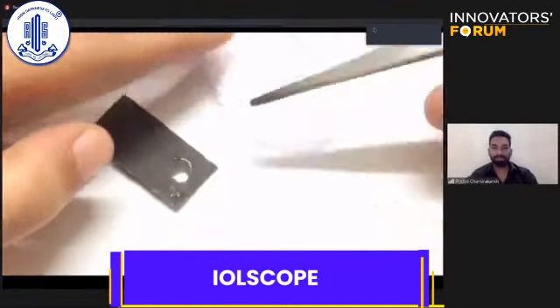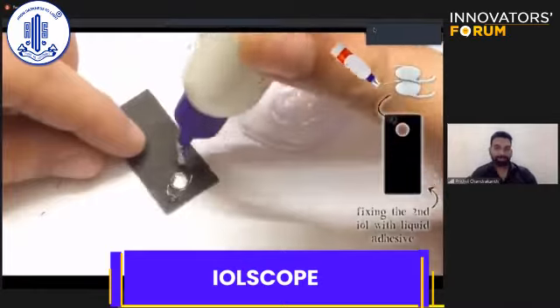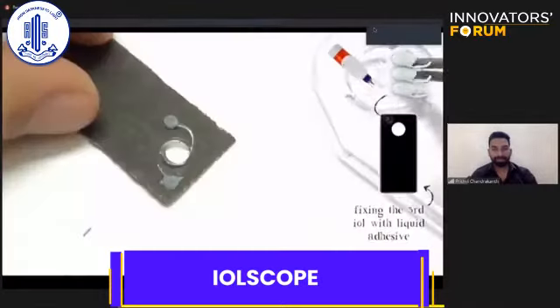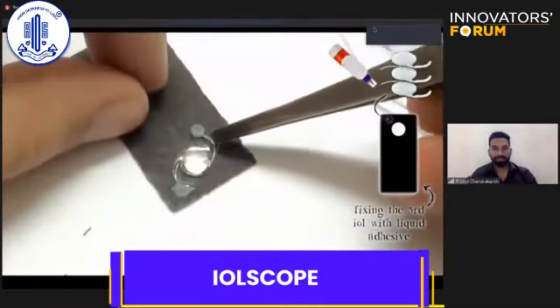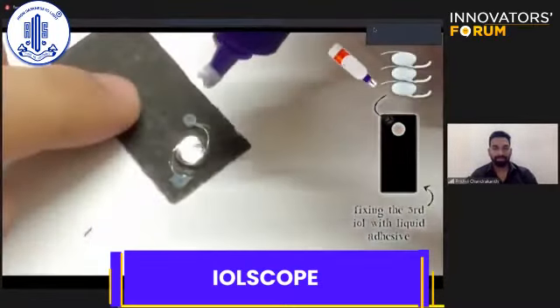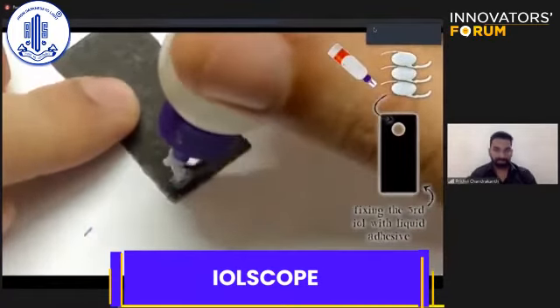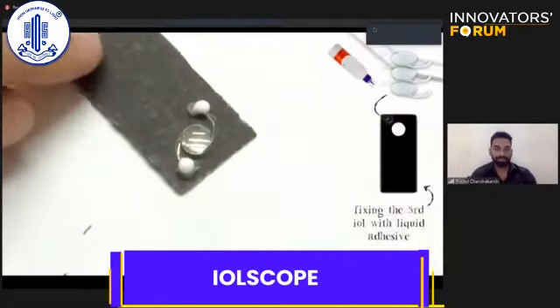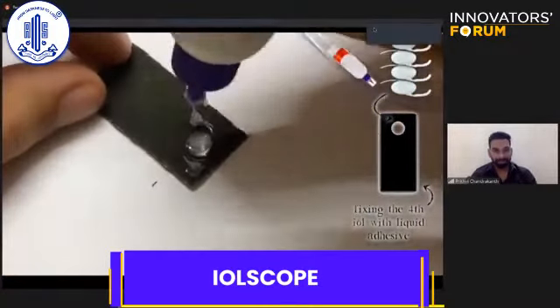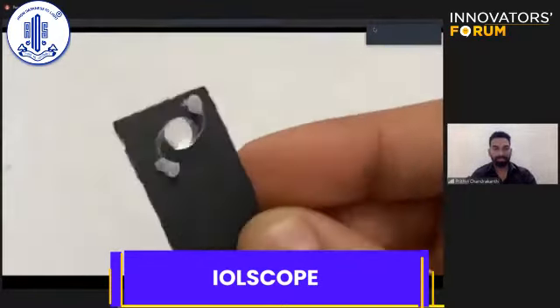Once it dried up, you can take the second piece of IOL, keep it on the first IOL, put the liquid adhesive. Do the same procedure for the next 2 IOLs. IOLSCOPE is ready.